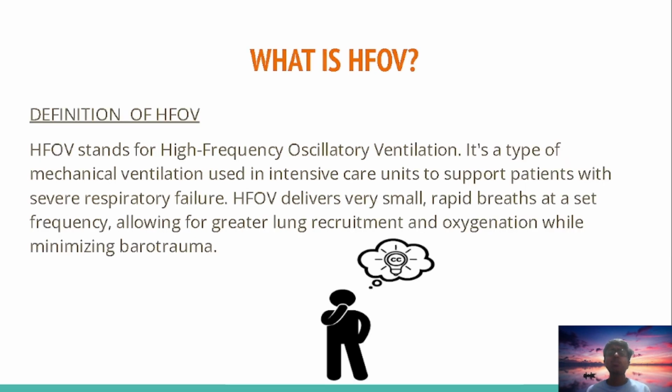So what is HFOV? HFOV stands for high frequency oscillatory ventilation. It is a type of mechanical ventilation used in intensive care units to support a patient with severe respiratory failure. HFOV delivers very small, rapid breaths at a set frequency, allowing greater lung recruitment and oxygenation while minimizing barotrauma.